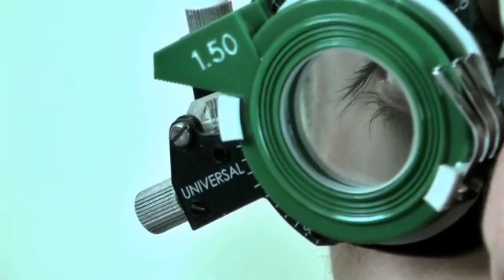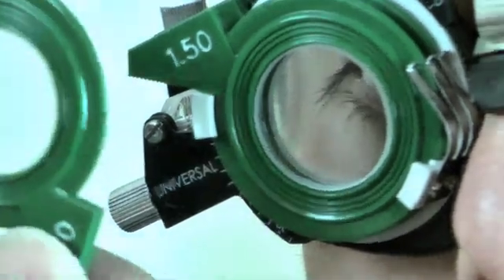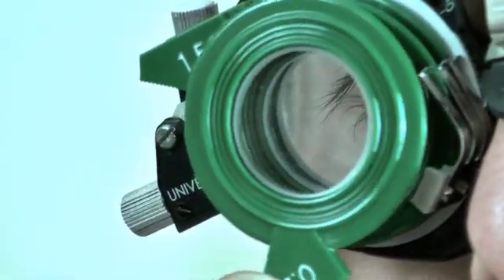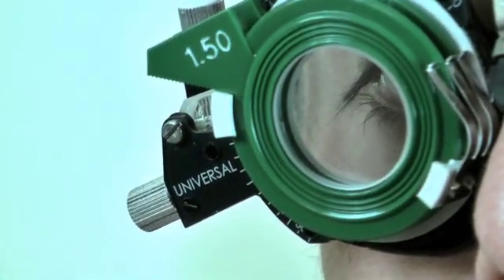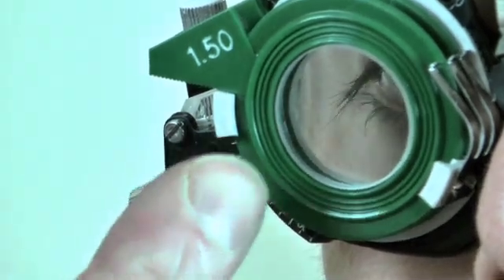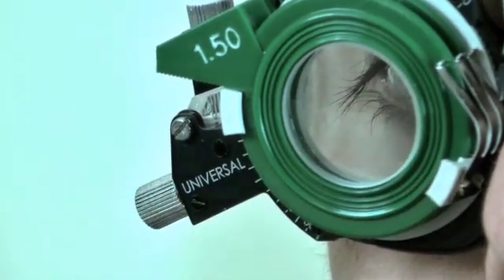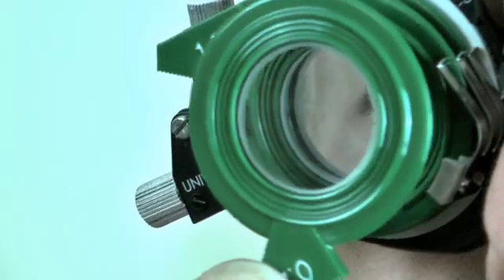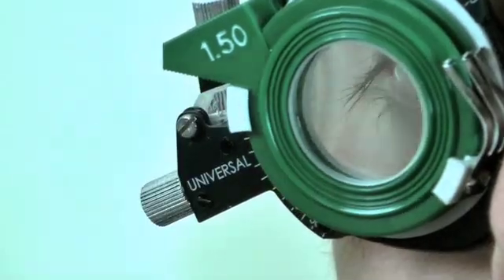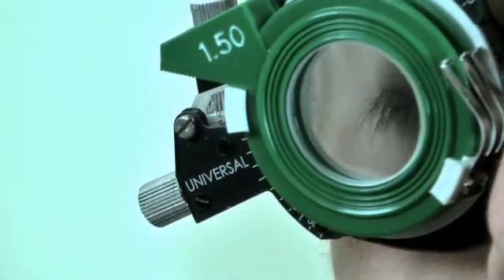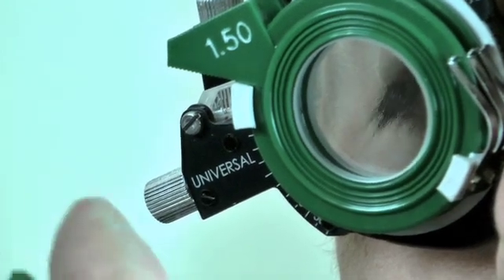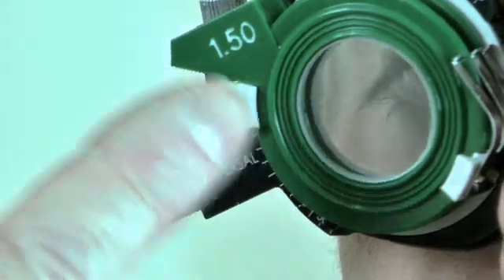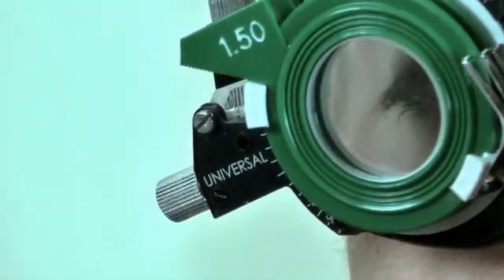You don't have to put it into the frame. You can just offer it up and say, is it better with that, or is it better without? If they say it's better without, we keep them with the 1.50. If they say it's better with, we can then replace the 1.50 for a 1.75. 1.75 is 1.50 with plus 0.25 added to it, so we can put a stronger lens in.